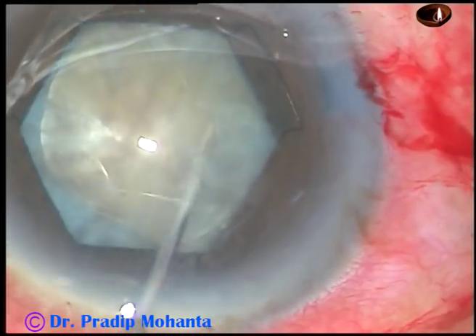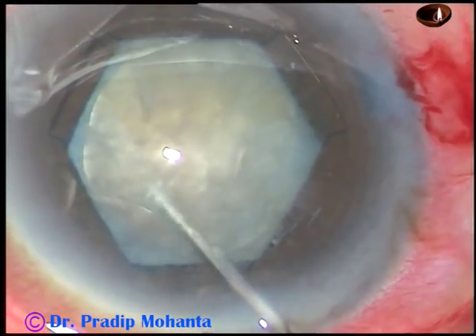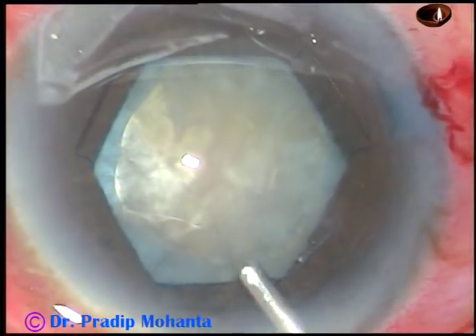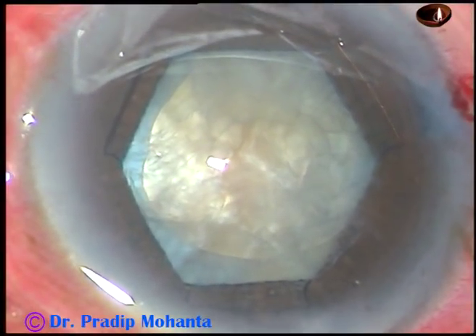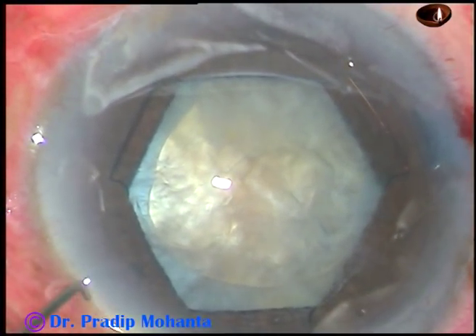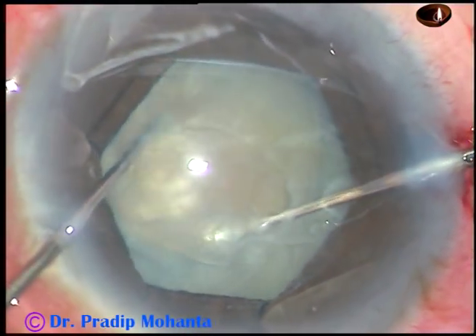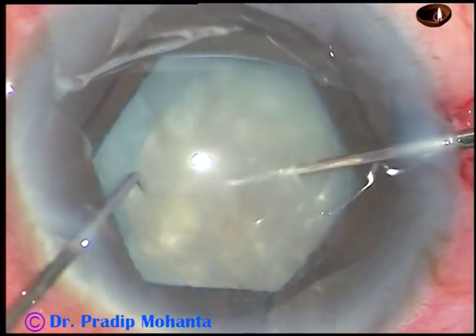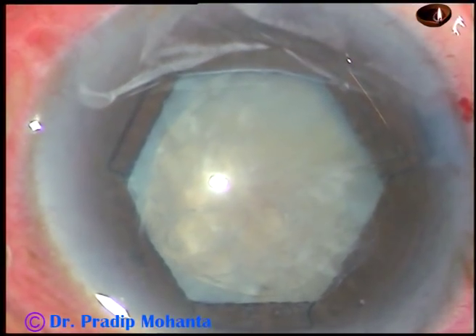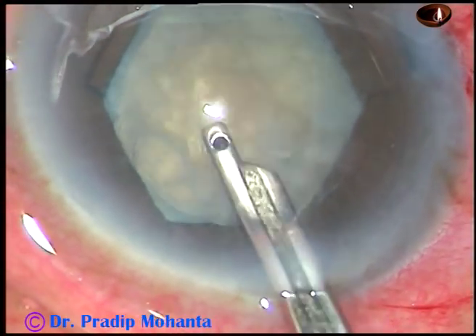The zonules were weak in this case, and I had to use a CTR, which we will see shortly. I cannot rotate the nucleus with one hand, because if we rotate the nucleus with one hand, zonular stress is more. But with bimanual rotation, zonular stress is less. So in weak zonules, please rotate the nucleus bimanually.